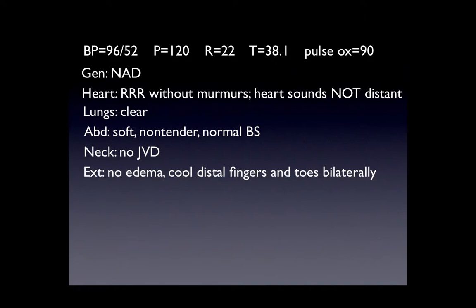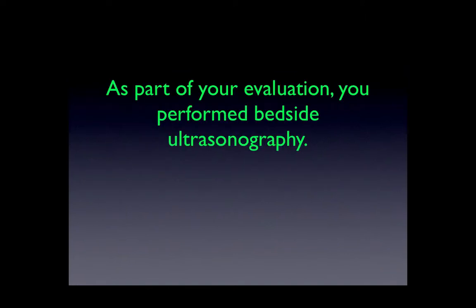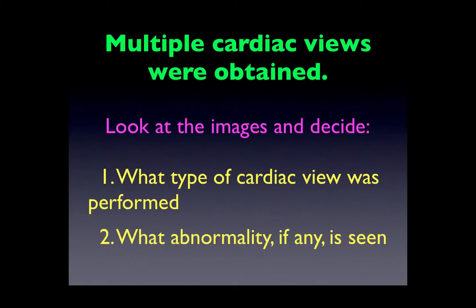Examination of the extremities reveals no edema. His distal fingers and toes are cool bilaterally. His neuroexam reveals a slightly confused male who is conversant, and there are no lateralizing findings. As part of your evaluation, an ultrasonography exam is utilized. Multiple cardiac images were obtained in this case.